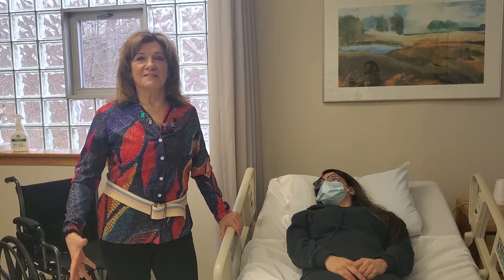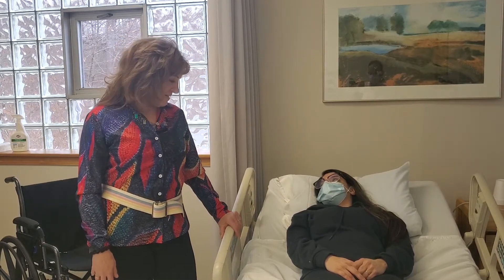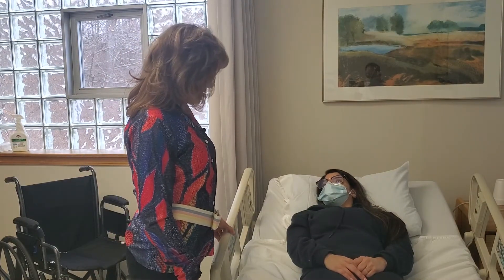People don't like the name 'hospital bed,' and you would have to get that from your clinician. So, Cassandra, we're going to get you out of bed into the wheelchair. Perfect.